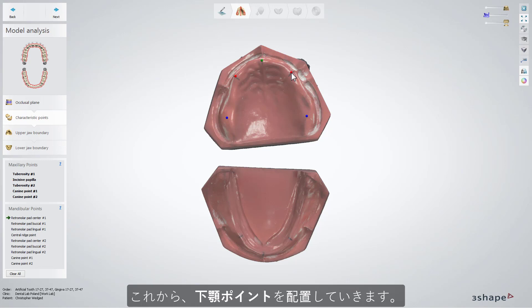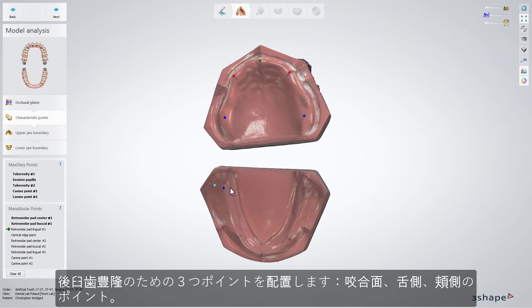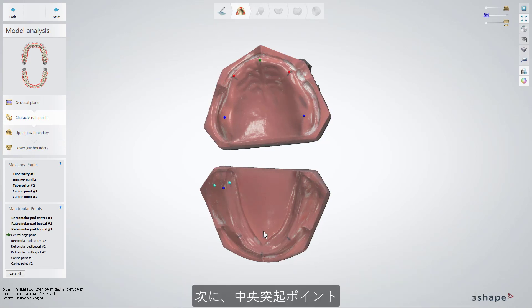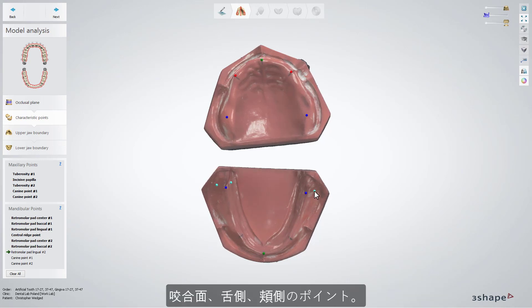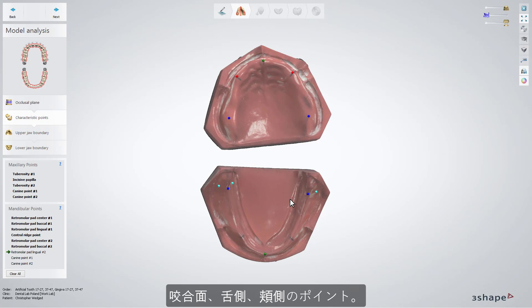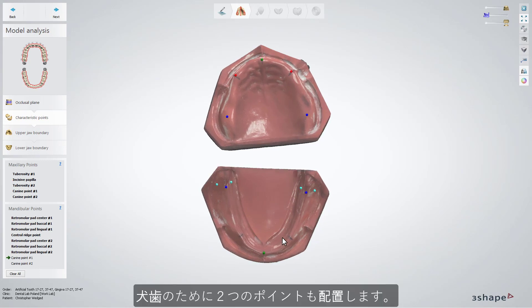Now let's select mandibular points. Start with three points for retromolar: center, buccal, and lingual. Then comes the central ridge. Another three points for the second retromolar: center, buccal, and lingual. And two points for canines.